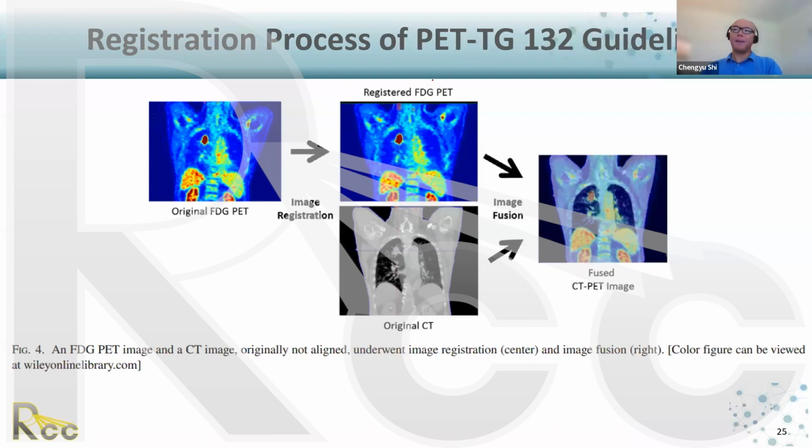And definitely PET is becoming more common in clinic. For example, there's a modality called RefleXion. It's PET-LINAC. It integrates PET's ability with LINAC. It's similar to MR-LINAC. You heard about that, right? MR modality with LINAC. Here, with PET, we get the functional image. You lose the anatomy. Some anatomy is still there, like the spine, right? And you can use that to match your CT if you don't have PET-CT.